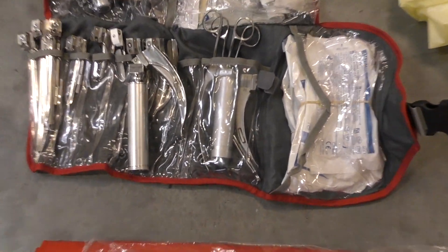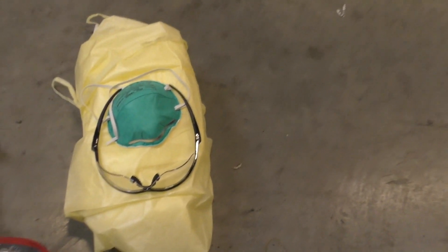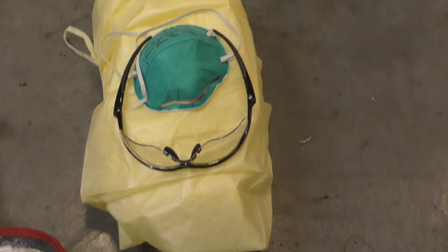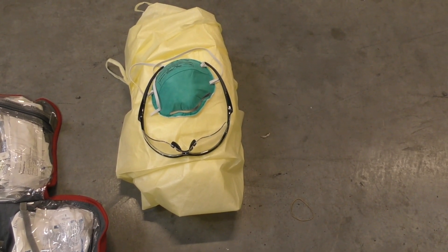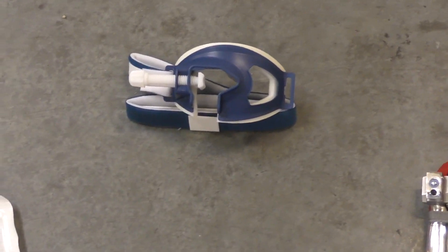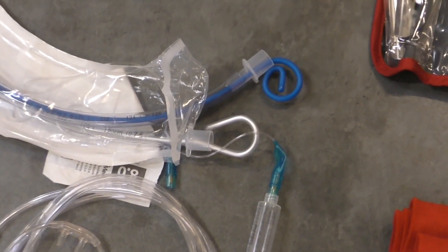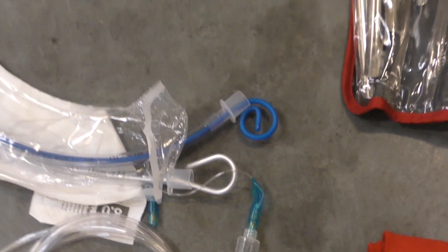I have my blade pre-selected — a Mac 4 ready to go, tested, and the light is working. I have my PPE: an N95 mask, a gown, and eye protection. Very important that everyone helping you has the same type of protection. I have my tube holder open and ready to go so I'm not fumbling around with plastic. I have my ET tube — the cuff is tested. I have an 8.0 and also a 7.5 ready to go, both open in the case.